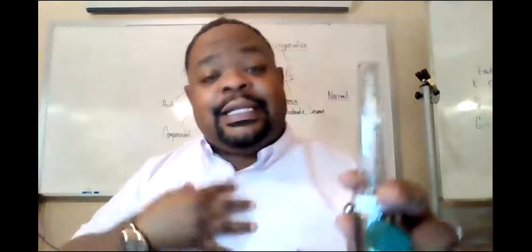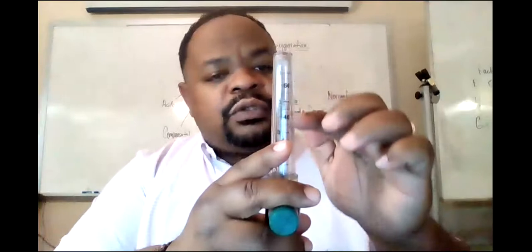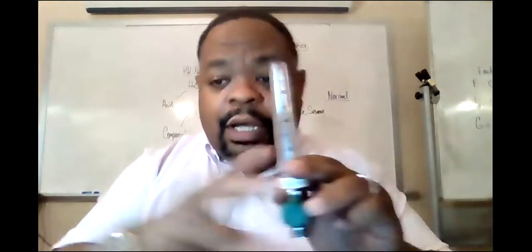Now the oxygen is not getting to me, and a compensated Thorpe tube will let you know, right? It's accurate in the face of back pressure. So if it's sending oxygen to me and I kink it, that's back pressure going back to that. And it's going to say, hey, something not right. The ball will start to drop, okay? When I undo the kink, the ball will go back to where it is.